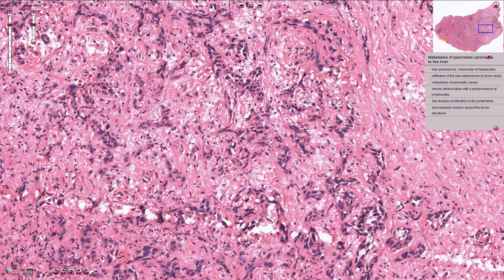On higher magnification we can see malignant cells that form some ducts here and there, but those ductal structures are not well formed. We can see something that looks like luminal formation; however, a lot of these cells just create solid small nests.